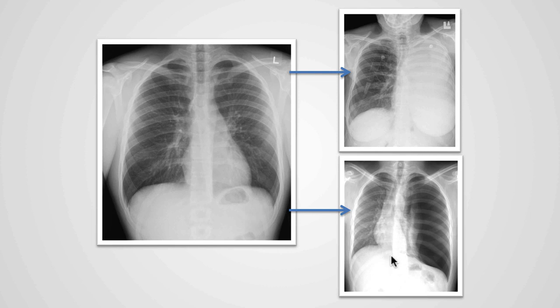In this example, we see that the left hemithorax is too black. The reason it is too black is because there is air outside of the lung. We will learn more about this in later presentations, but what this patient has is a pneumothorax. And because the heart and mediastinal structures are shifted to the right side, this is called a tension pneumothorax.